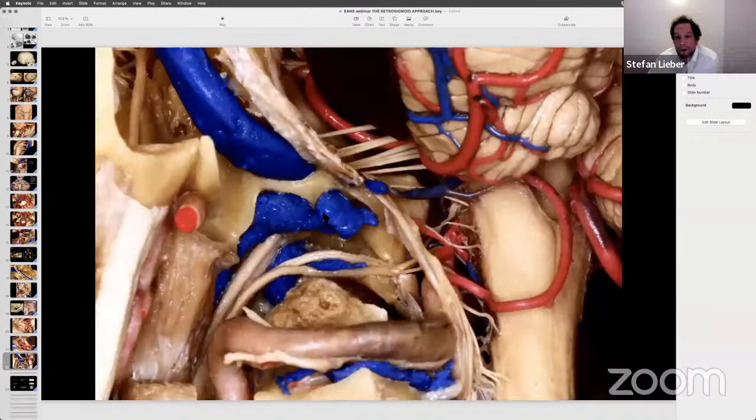And this final exposure, just showing again an extended view, with the inferior extension of this far lateral condylar exposure, with the V3 segment of the vertebral artery, anterior segment of the artery. And I just wanted to show this to demonstrate that the nerves coursing into the jugular foramen always run medial and anterior to the jugular bulb, and are not at risk in this posterior exposure. This is the extracranial course of 9, 10, 11, and the hypoglossal canal fibers running. This is the ascending fibers. The hypoglossal canal obviously is exposed more anteriorly.